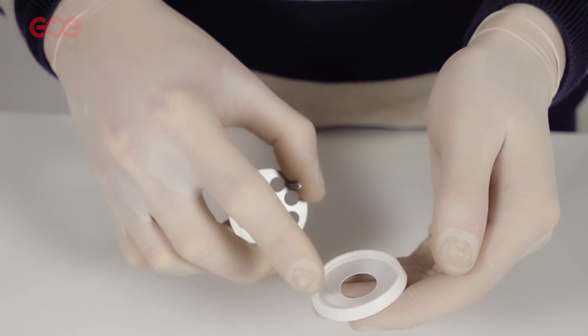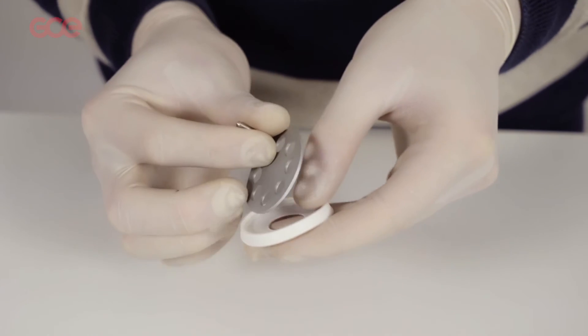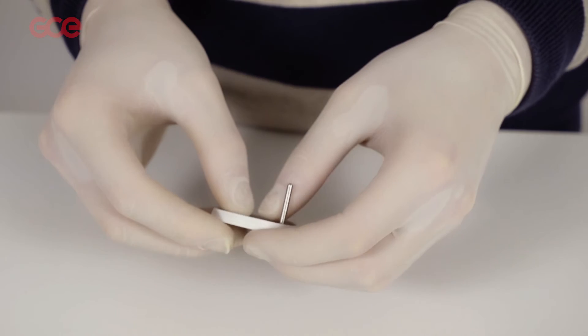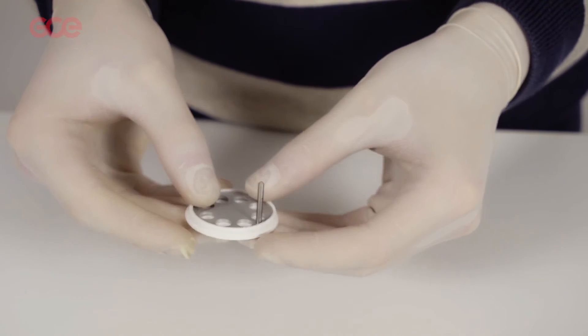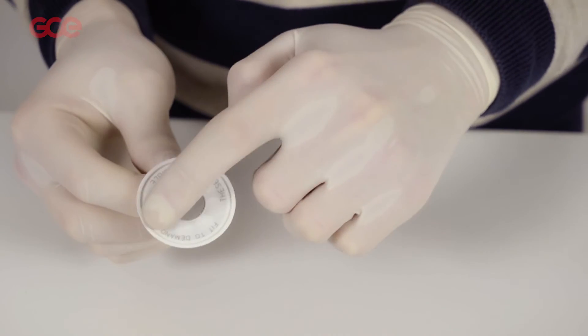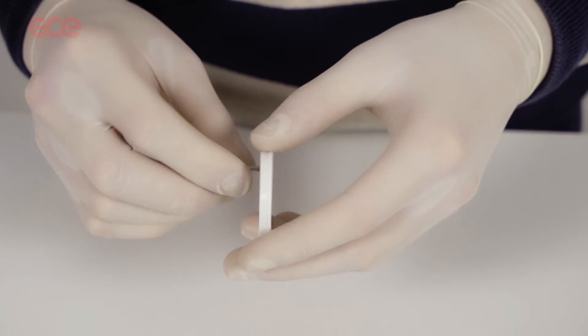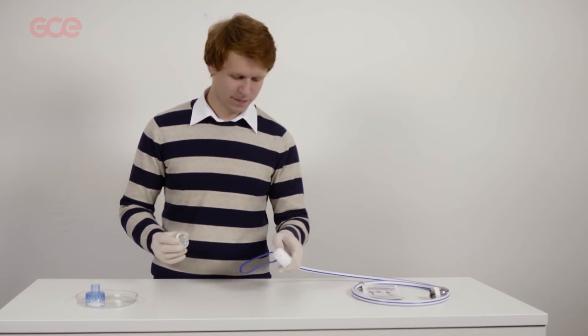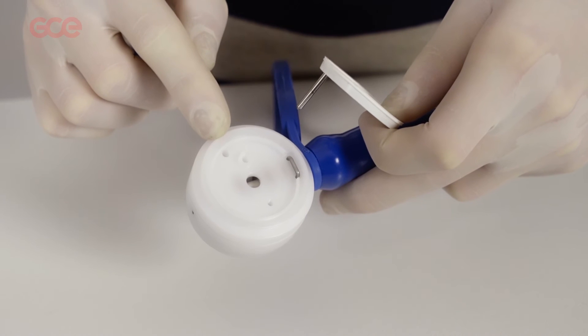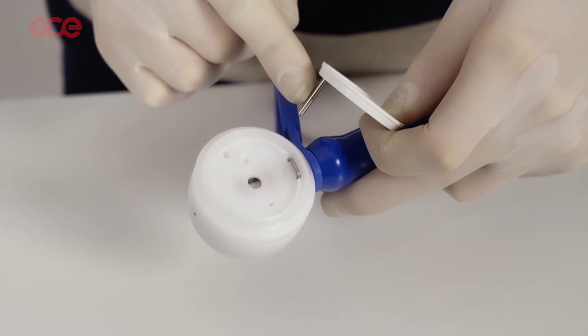Place the inhale flap back on the inhale disc. Make sure the rim is placed over the inhale disc and the letters facing up. Place the inhale disc assembly into the demand valve.